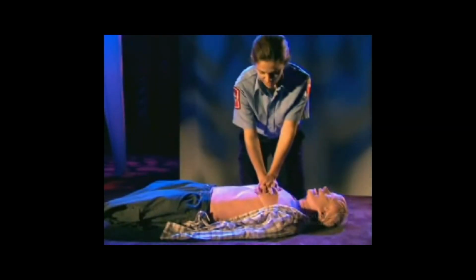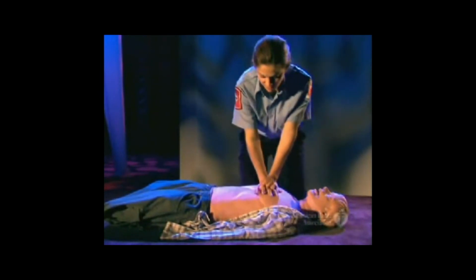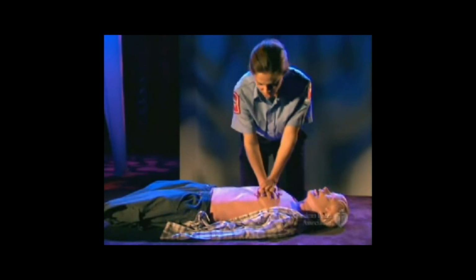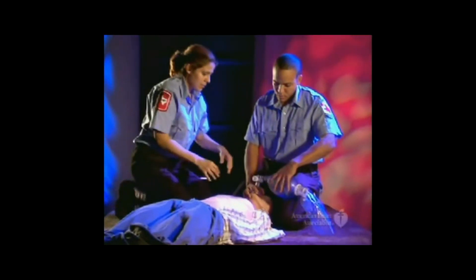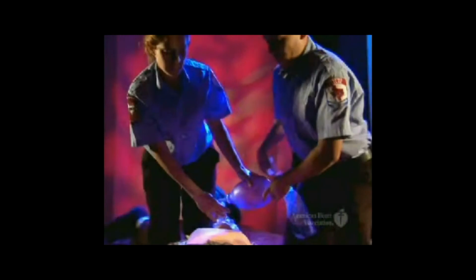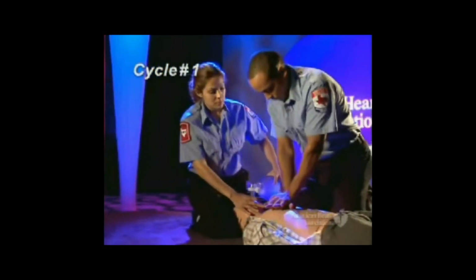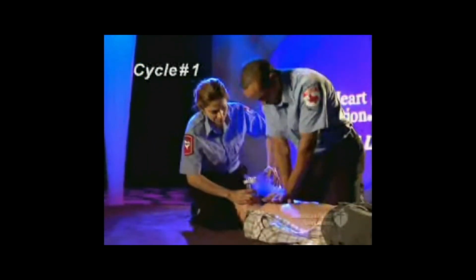When another rescuer is available to assist with CPR at the scene, the second rescuer should activate the emergency response system if he or she is not already done so, call EMS, and get an AED. Help is on the way. In 2 rescuer CPR, each rescuer has specific roles. The first rescuer performs chest compressions and counts out loud. The second rescuer maintains the open airway and gives breaths.